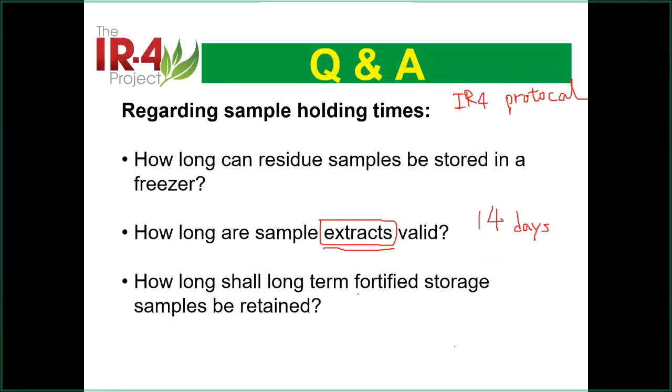When it touches water, it's going to hydrolyze. The half-life is, I think, 14 days-ish. So after 14 days, you only have 50% left. So IR4 protocol requires 14 days. So it's mandatory to put the number there. It does not mean this is scientifically what you must do. Yeah, sometimes longer than 14 days, you will get a good recovery.